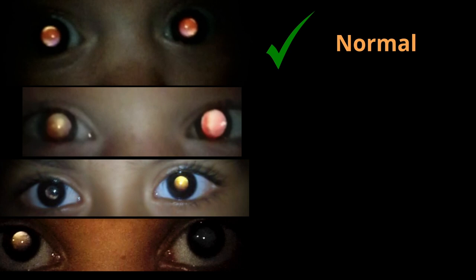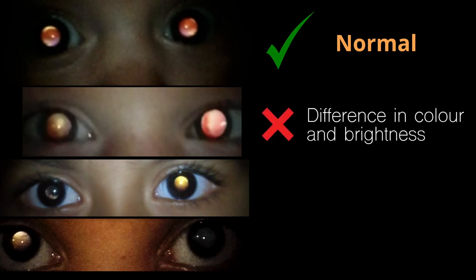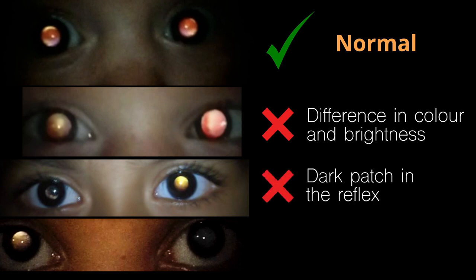An abnormal fundal reflex is when there is a difference in the brightness and colour between the two eyes, a displaced corneal reflection, a dark patch present within the reflex of one or both eyes, or a completely absent reflex.